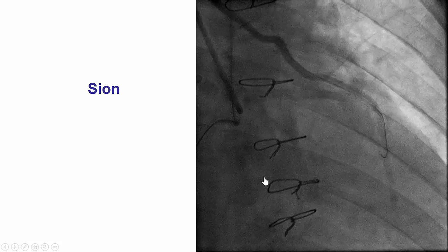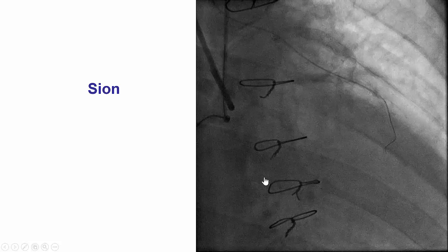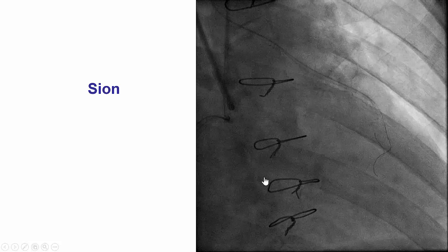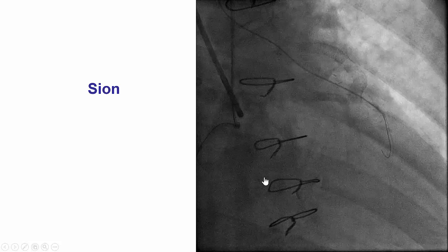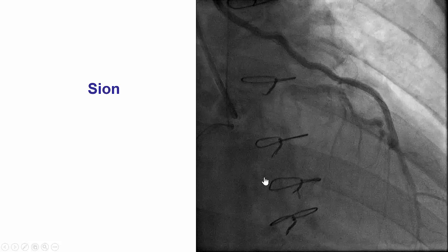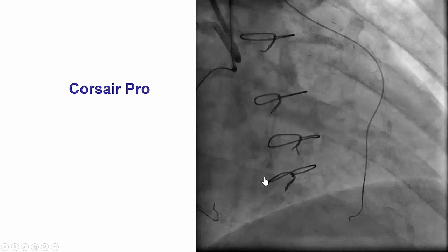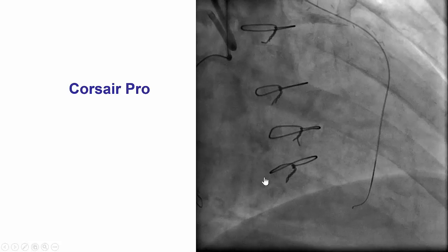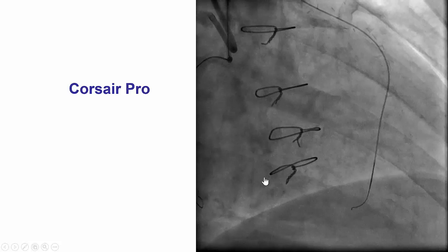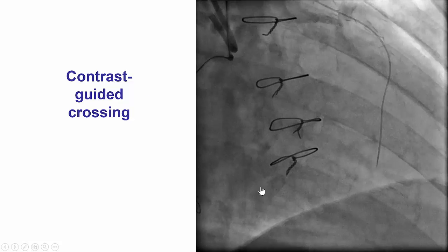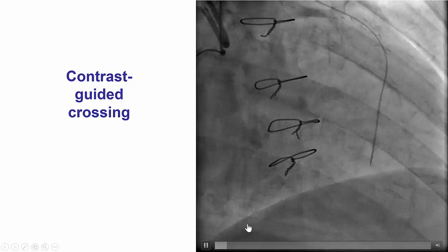We advanced a guidewire and the Corsair Pro microcatheter through the LIMA and waited a few minutes. The patient remained hemodynamically stable without EKG changes. We were then able to advance a Sion guidewire retrograde into a septal branch. The Corsair Pro was advanced with difficulty into the septal, and then we performed an injection of contrast to determine the course of the collateral into the occlusion.